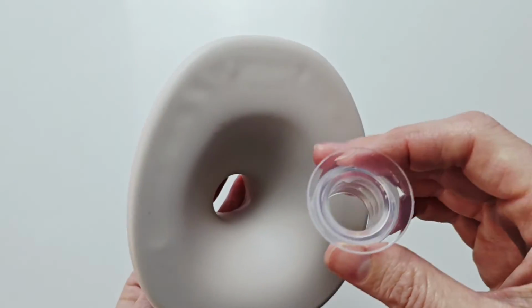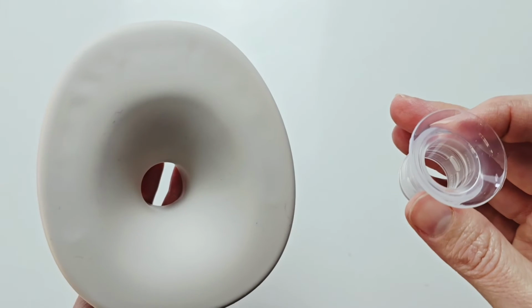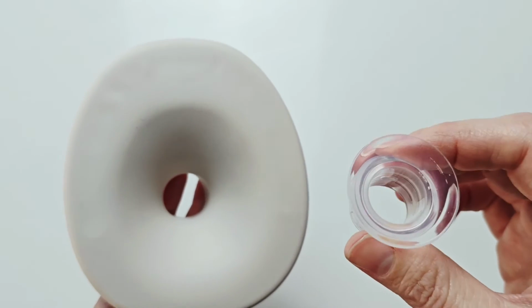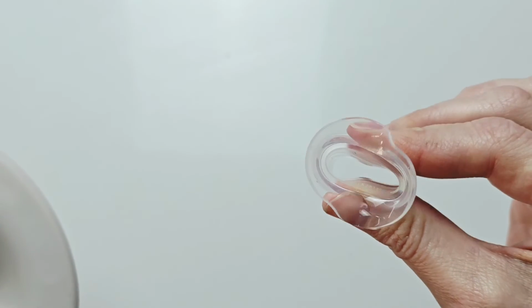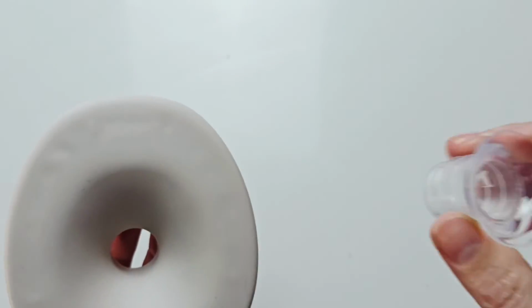However, that said, if you're somebody that stabilizes quite easily within your pumping journey and you are regularly using the same size flange insert, then every 6 to 9 months, or if you lose the durability of it. So if it's floppy and it's really lost that bounce, then it's a good time to change it.